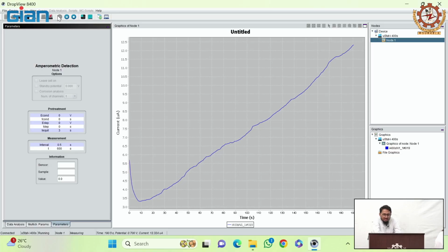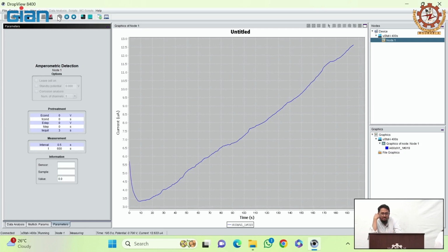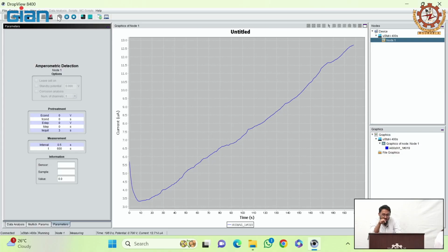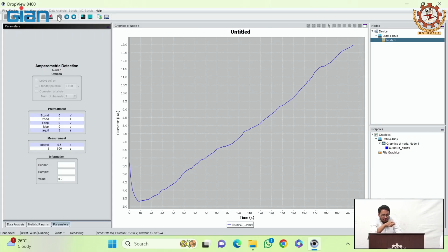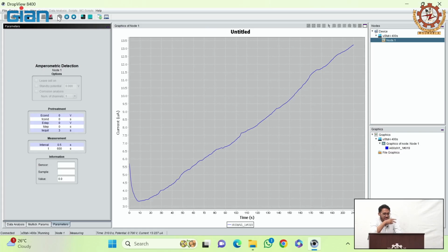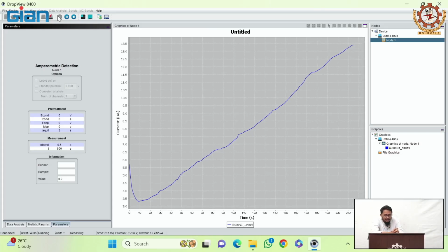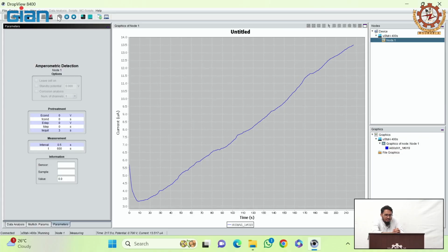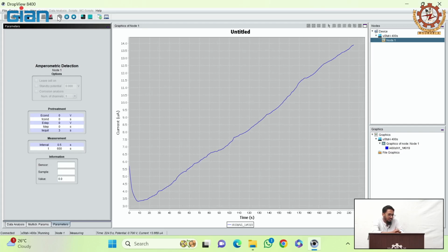That is a connector, and there might be some polymer electrode attached to it. If you look, there are 3 dots on the polymer electrode. Those are the 3 electrodes. What they have done is combine all 3 electrodes in a single polymer. Instead of having 3 separate electrodes, they have managed to combine them in one, so it's convenient. That's part of their technology. There might be some IP behind it. We are not sure how they have done it.